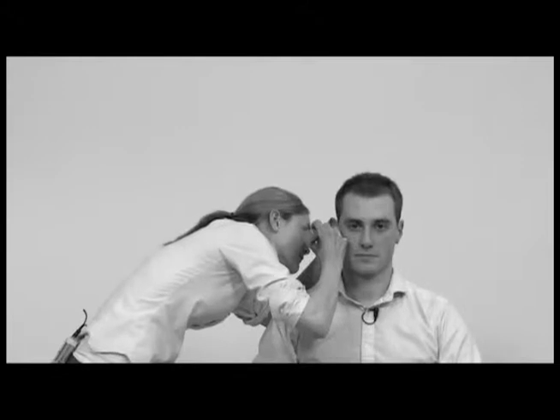With your free left hand, pull the pinna gently upwards, outwards and backwards to straighten the external ear canal to allow a better view of the tympanic membrane. In children, pull the pinna down and back instead. Insert the otoscope into the external auditory meatus and inspect the canal for wax, discharge, inflammation and other abnormalities. Gently proceed down the canal until the tympanic membrane is seen. Move the speculum around to examine the whole of the tympanic membrane and identify the normal landmarks.